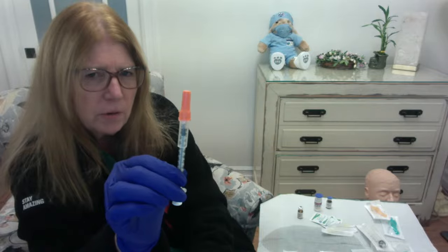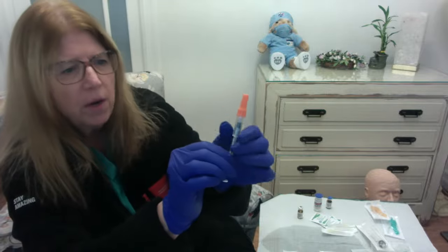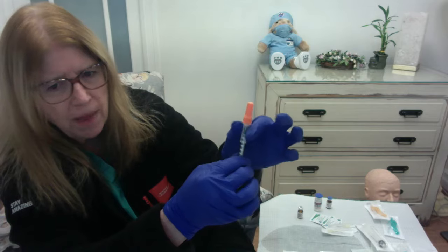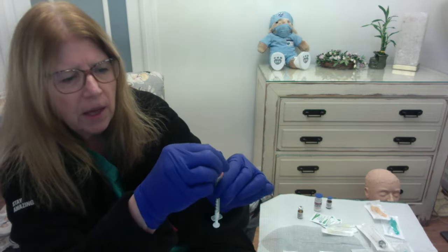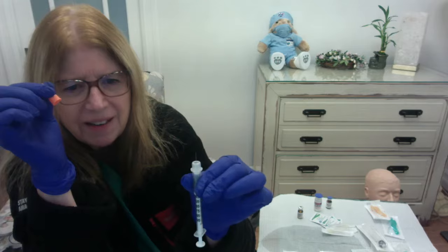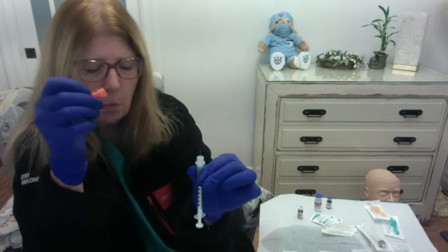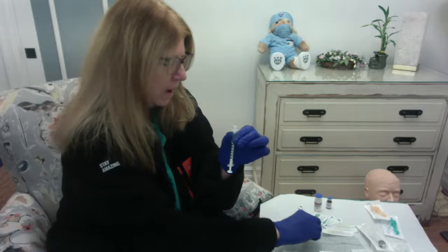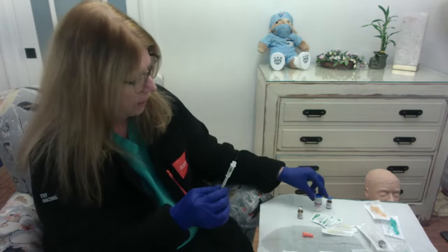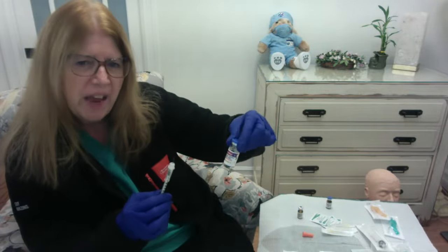So you have to be careful not to engage that safety when you are drawing up your medication or even while you're taking the cap off. So you want to hold this syringe by that piece, okay, and take the cap off again by just pulling upward. And you can see what a teeny tiny needle that is, right? Very short and diameter wise very small. Okay, I'm going to put my cap down on its side, and because I'm going to be opening up this vial of insulin, I'm going to put the air in.